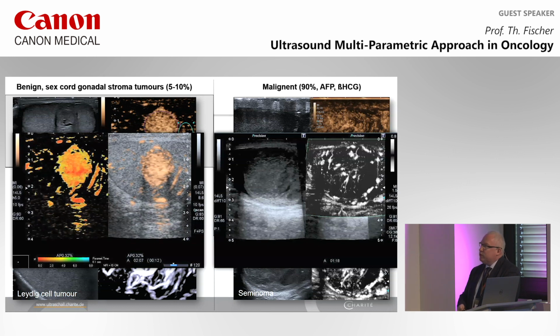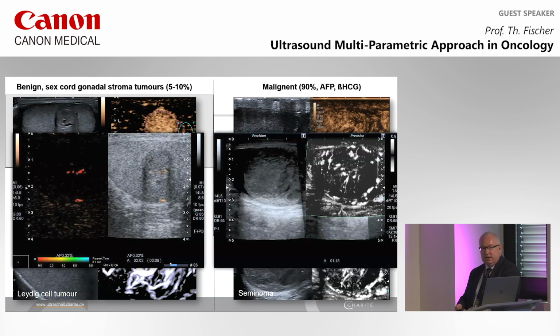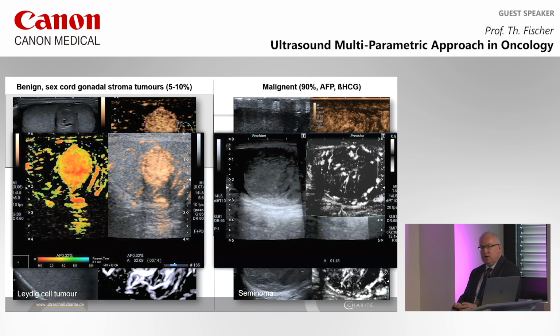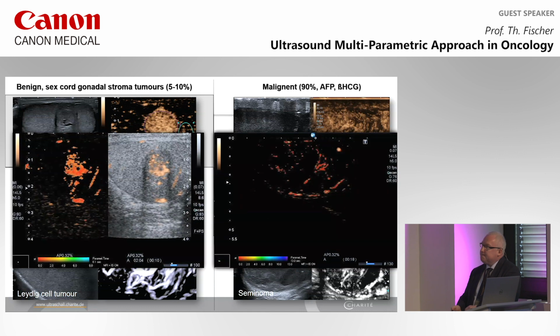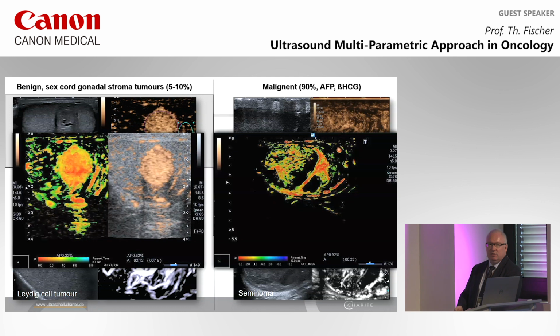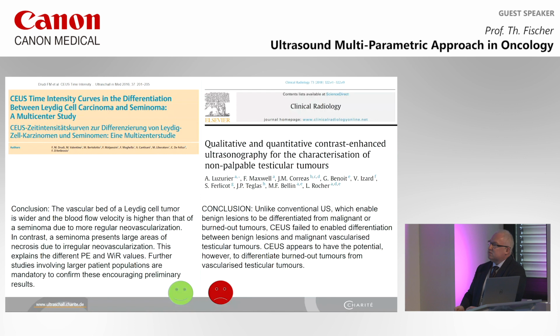So that means we are able to get in touch with this topic if we deal with vascular architecture as well as with contrast inflow pattern. So we have to have a mixture of different techniques, in my opinion. And once again, the arrival time, where we can see perfectly here the necrosis of the tumor, these chaotic vessels, these different arrival times. So that means everything is possible. If you look in the literature, it's the same as in your audience. Sometimes yes, sometimes no. That's exactly the view at the moment. That's the current status of publication.